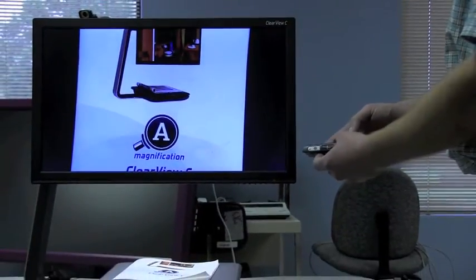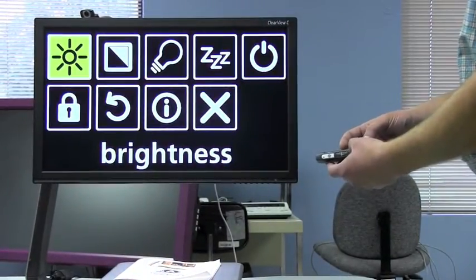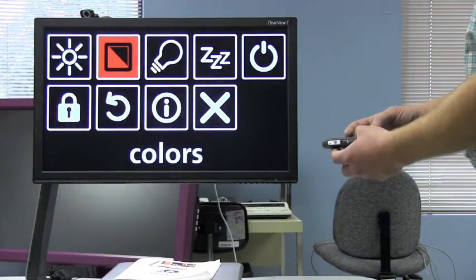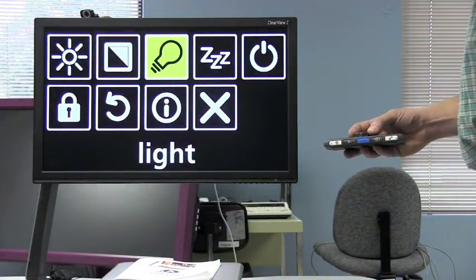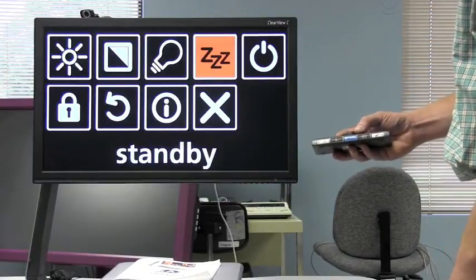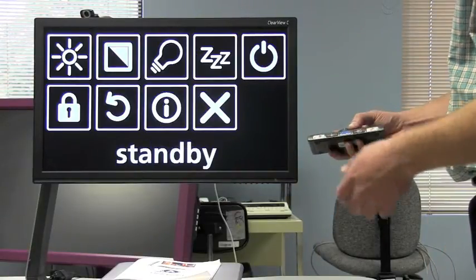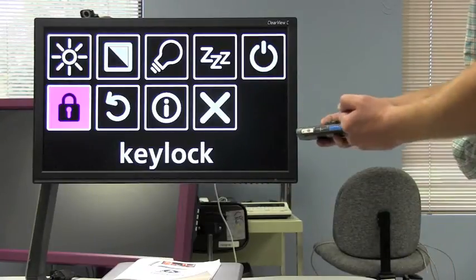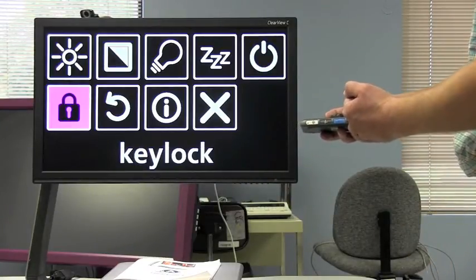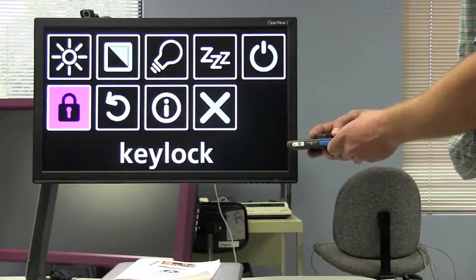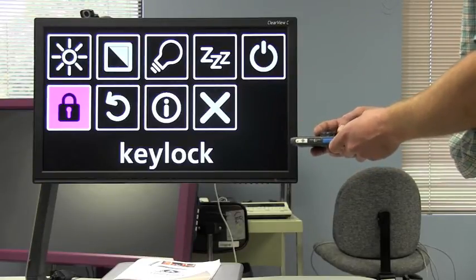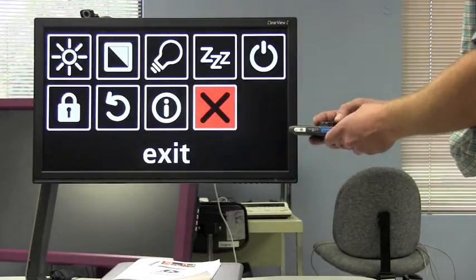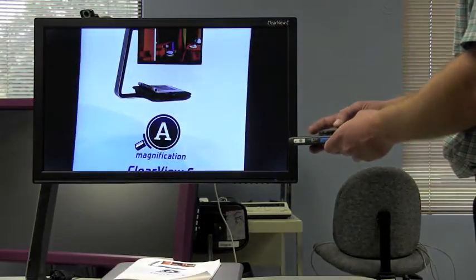You have a menu that you can get into here where you can access all kinds of different things. You can adjust your brightness. You can adjust the colors. You can adjust the actual brightness of the light here. You can turn on standby mode or a snooze mode. You can lock these keys here so that if somebody doesn't care about all of these features, you can lock these keys so that they won't even work. So you have all of these different menu options that you can use and then obviously you can exit your menu.